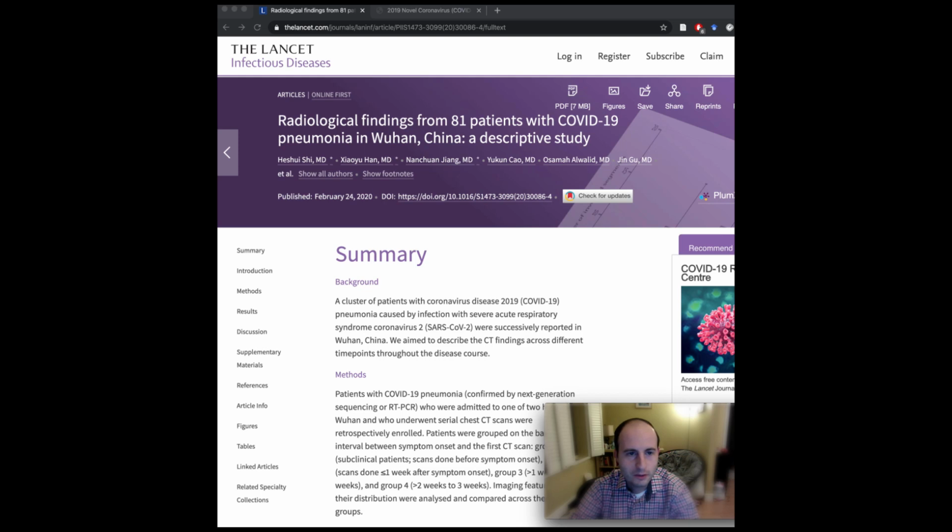I thought I'd talk a little bit about what's been on everyone's mind, which is obviously COVID-19. Talk a little bit about imaging techniques and imaging findings, just as an overview. So, just like with any pneumonia, really the first step in evaluation after clinical evaluation is going to be chest radiography.